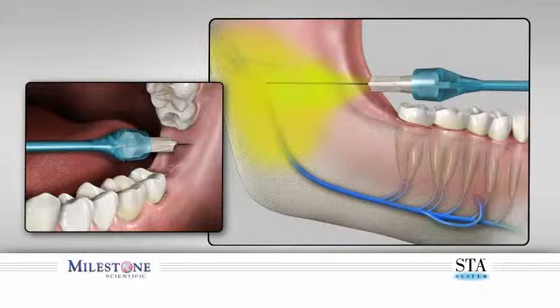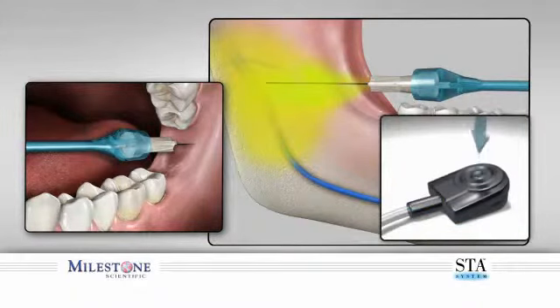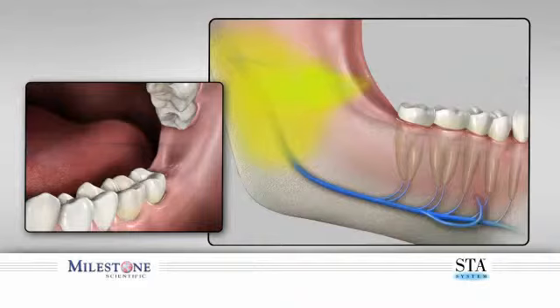When you have delivered the required dosage, you can remove the needle. To avoid anesthetic solution sprayback into the patient's mouth, perform the following. While the needle is still embedded in the patient's tissues, depress and release the foot control pedal. Count 3 beeps after releasing the foot control, then totally remove the needle from within the patient's mouth. Direct the needle away from the patient as a small amount of anesthetic solution may still be present.